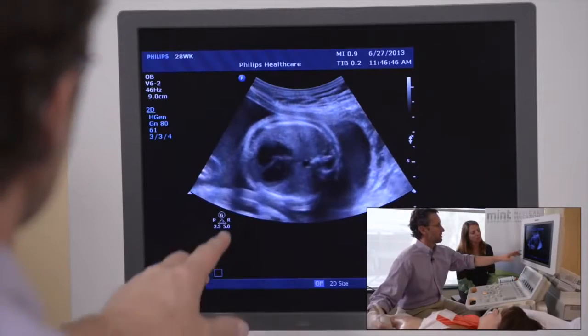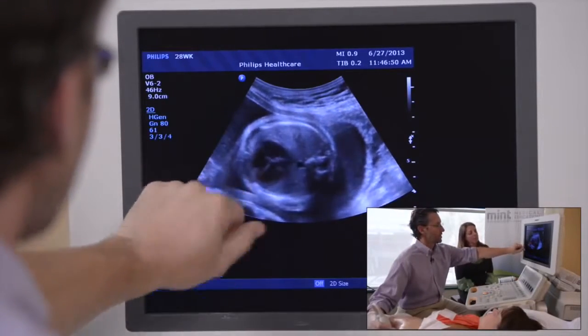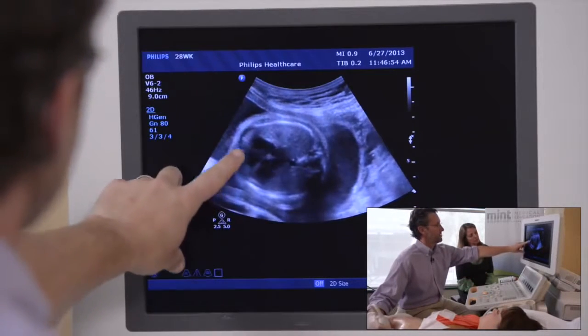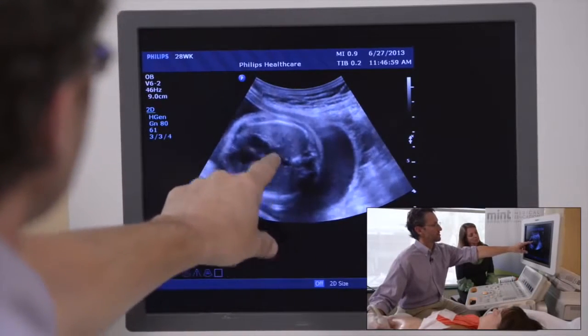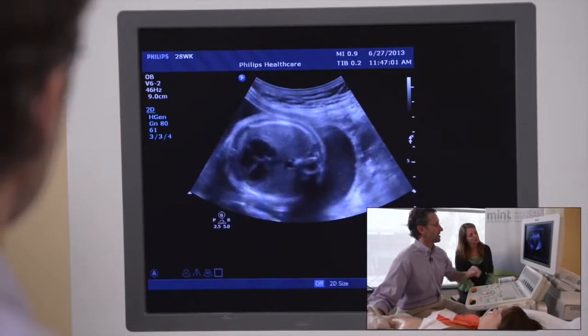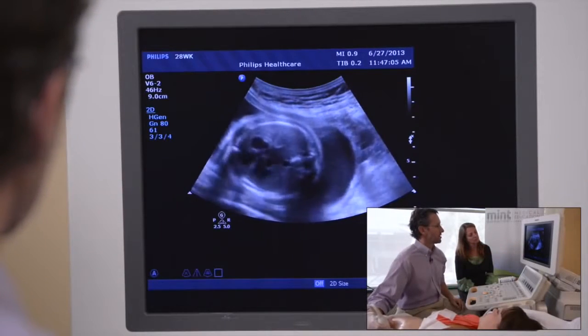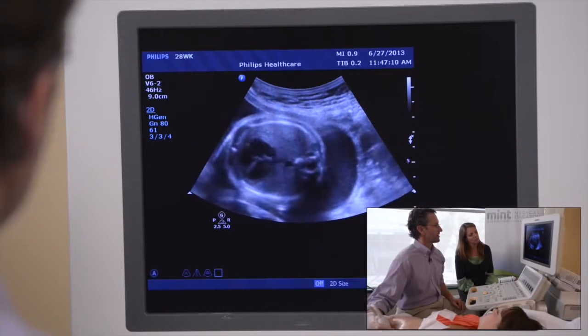And we always know, assuming normal heart anatomy, the right ventricle should be the most anterior chamber of the heart. So if we can name that as the right ventricle, then we know this is the left ventricle, and this must be the left atrium, and that's the right atrium. So that makes this the tricuspid valve and this the mitral valve.